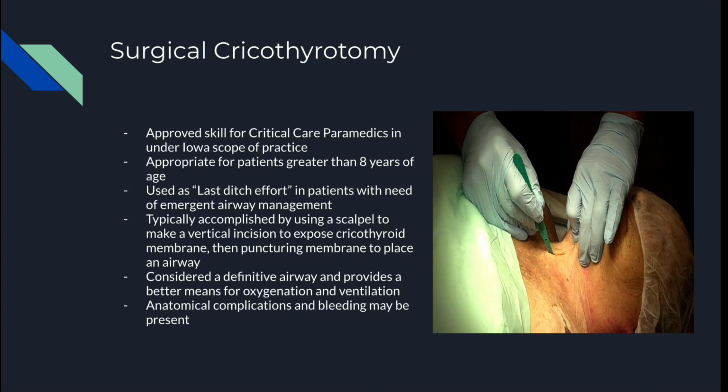Obviously, some of the complications that we may encounter with this, we've already mentioned: blood, probably lots of blood, and possibly some anatomical issues.